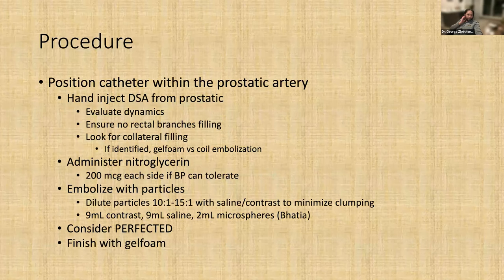You want to hand inject from the prostate artery. You don't over inject when the vessels are very small and delicate. I've actually perforated a prostate artery branch before. I do administer nitro whenever I can because the arteries are small. I want to get as much embolic in there as possible.